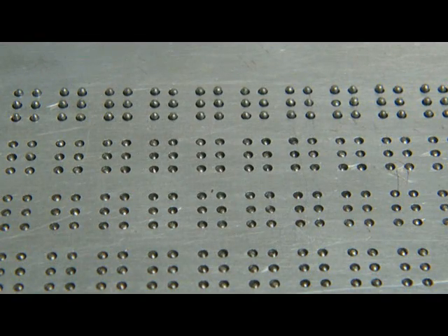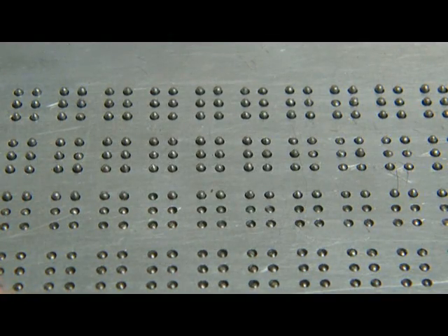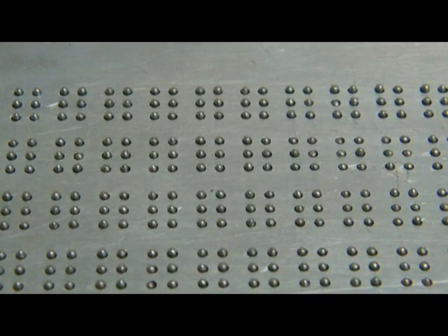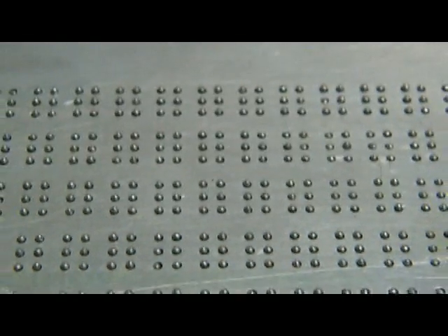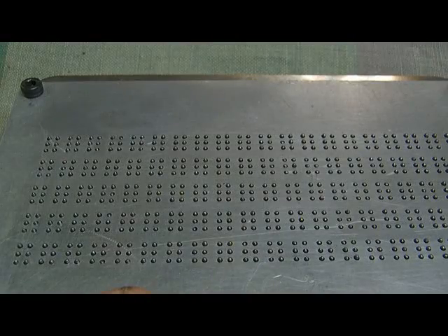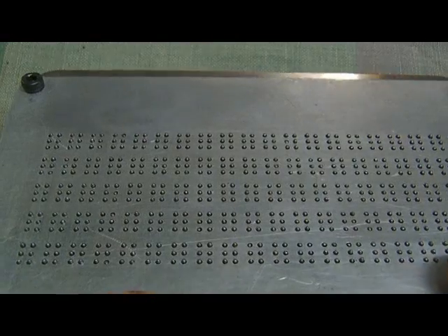I'll do it for the second line of cells. I'll do all three rows together. I'm pressing with my finger all three rows. I'm doing for all the cells now. If you can see now, I've got all the pins up in the entire display. I can zoom out slowly so that you can see. Okay, that's the display.